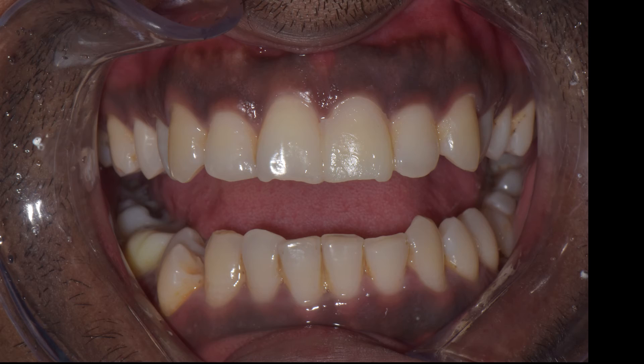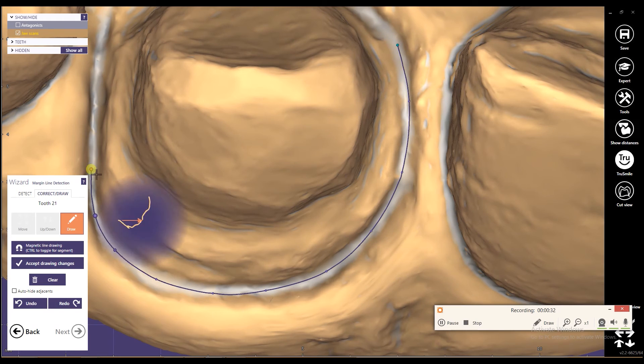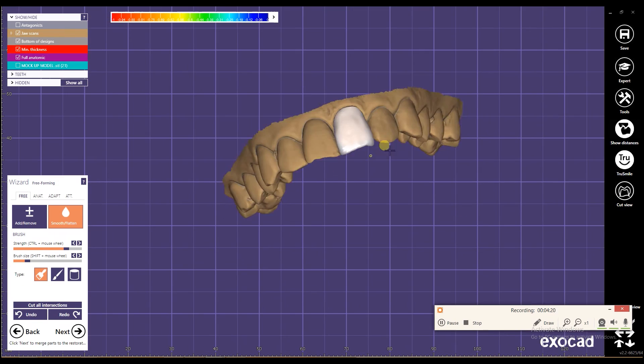You can see how effectively I have mirrored the adjacent central incisor to maintain symmetry. Once the file is received at Illusion Dental Lab, the restoration can be designed digitally, the coping can be milled and layered, and delivered to me.